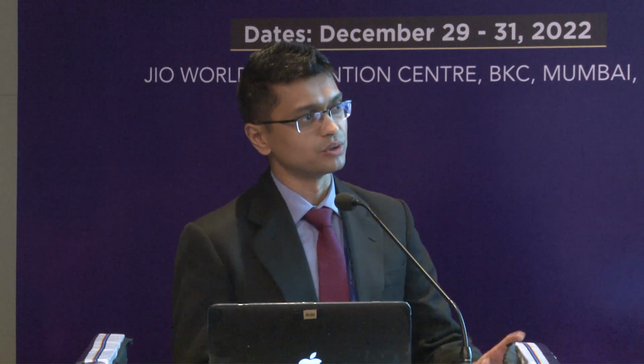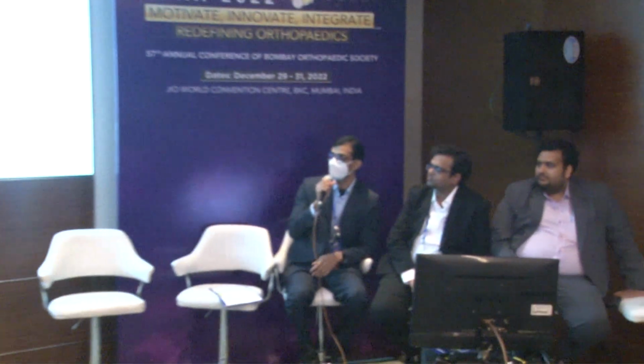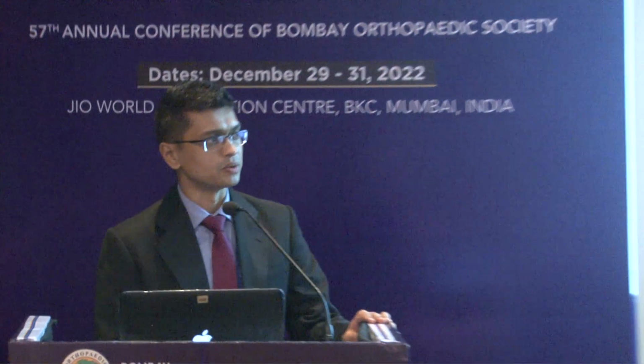Whereas some studies have always said that the meniscus will heal better, some studies have said that it doesn't make a difference. So I think we would have to largely go by what your personal clinical experience is with that. Thank you, sir. What number fiber wire do we use for meniscus? Generally we use a 0 fiber wire or a 2-0 fiber wire, but a 0 would be a sturdier one.